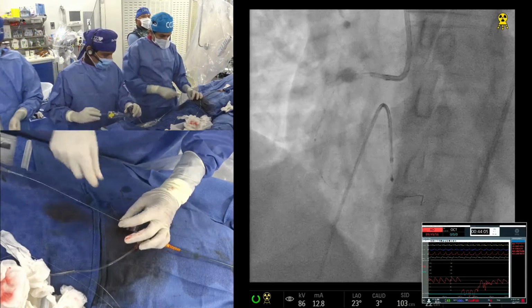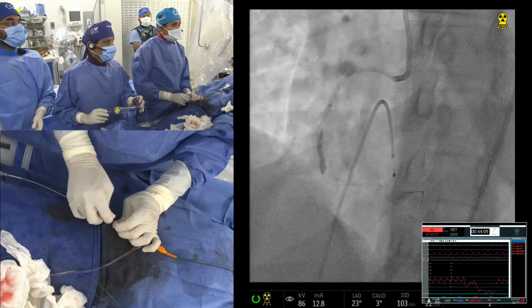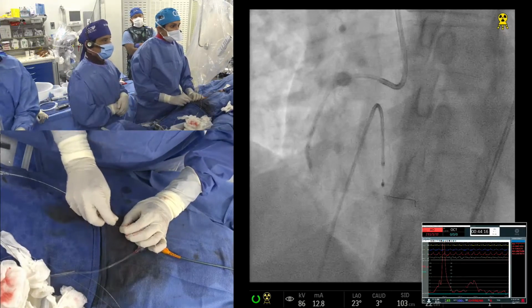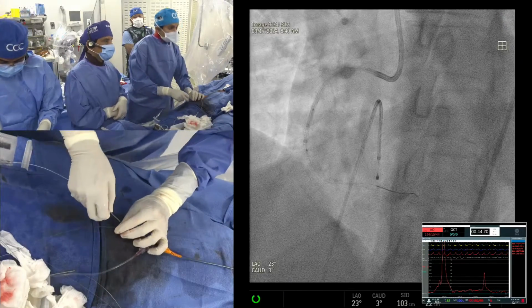Go. Okay. So we are going back again. We need to get a little further down on our. Okay. As soon as you're there, you deflate. Lovely advance. demonstration of Yeah. getting the guideliner there. I hope people notice that. Yeah.